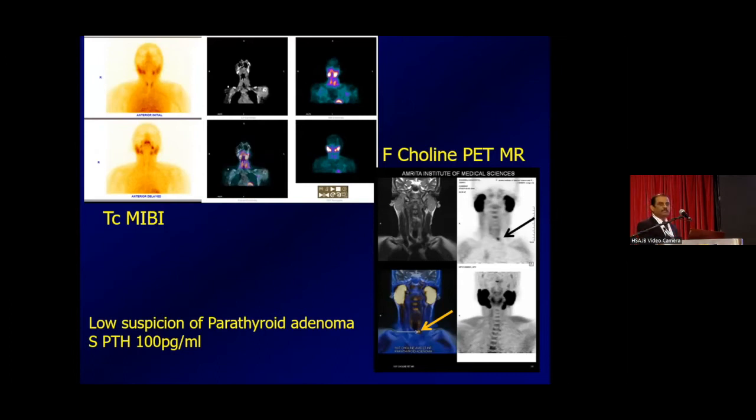So the same thing can be done in PET-MR also. We have the good fortune of doing this in PET-MR also. So this is a very low suspicion. Serum PTH is only 100 picogram, but still the parathyroid adenoma is picked up on the choline scan.